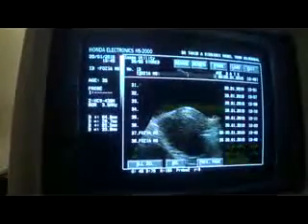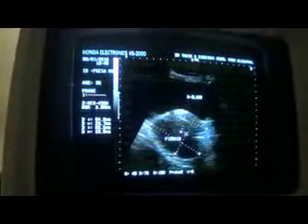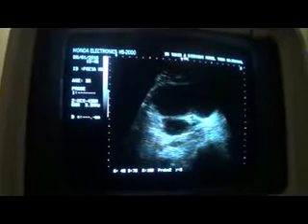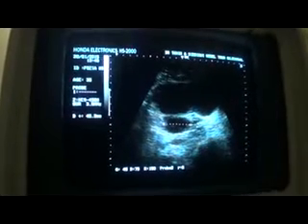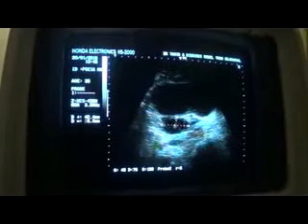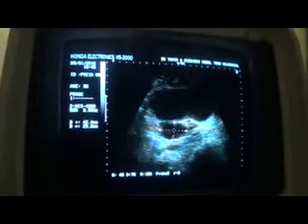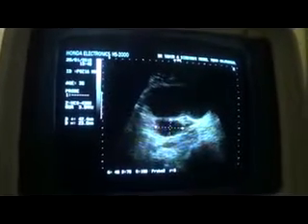Now let's see it in the adnexa. This is a small cystic area seen relating to the right ovary, measuring approximately 4.2 centimeters by 2.3 centimeters, and is consistent with a simple, uncomplicated retention ovarian cyst on the right side. What's the status on the left side? This is the left side.